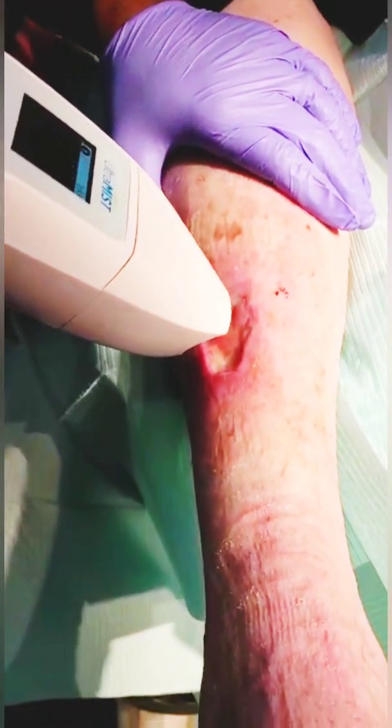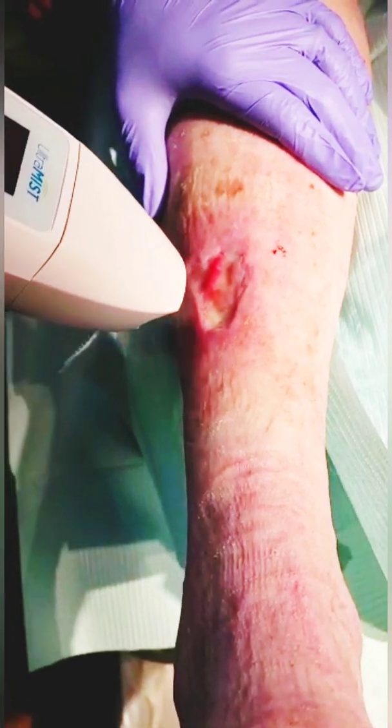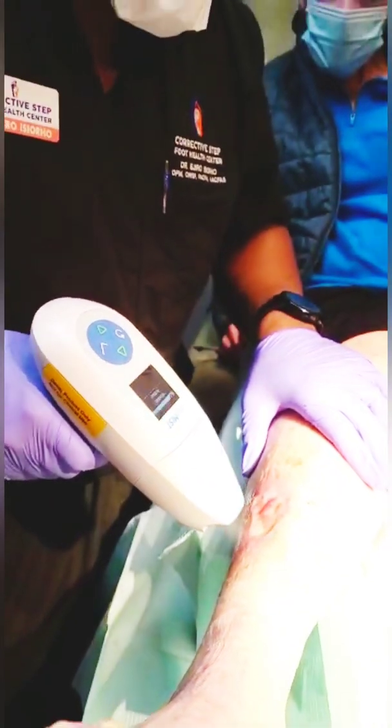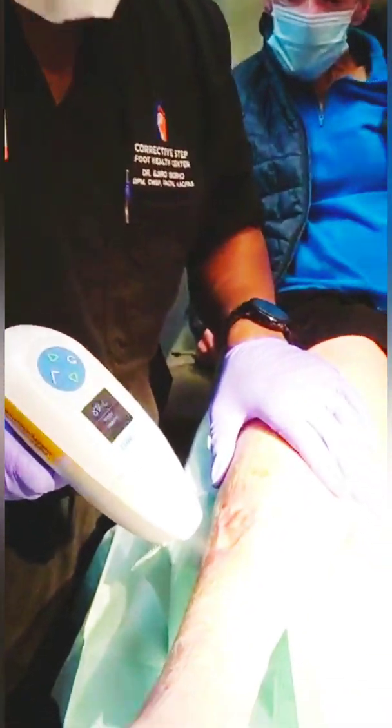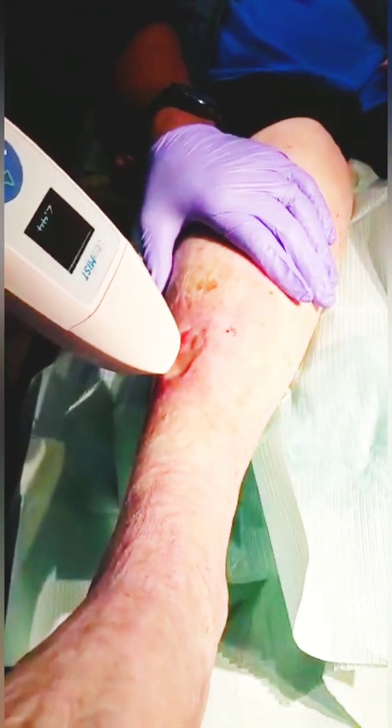On intact skin — not damaged — no harm, just sweat. And are you feeling anything at all? This patient unfortunately has a very, very tender and sensitive wound, so a lot of the debridements were very tender and painful. Is it indicated to go on the periwound skin as well? Yes, it's perfectly fine.